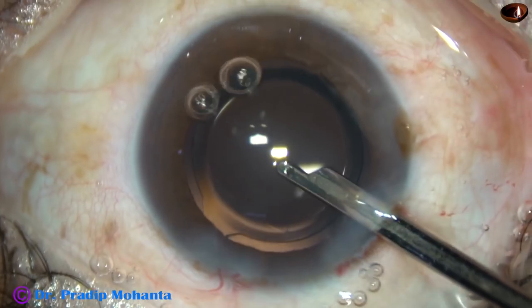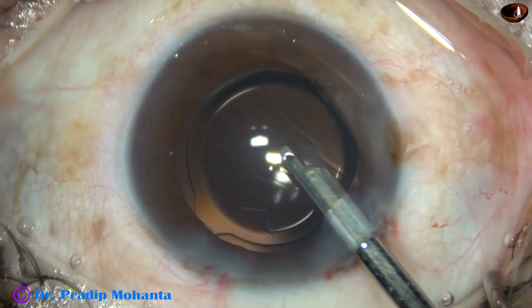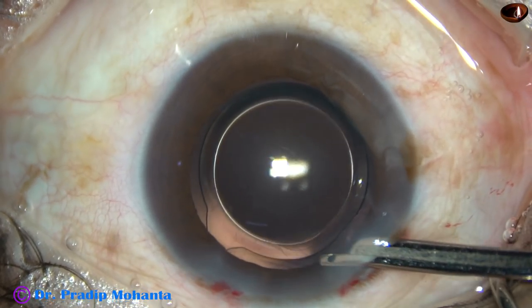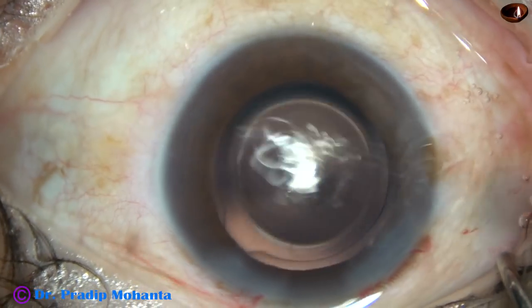And then this is the final lavage of the anterior chamber. The anterior chamber is nicely formed and the case is concluded.